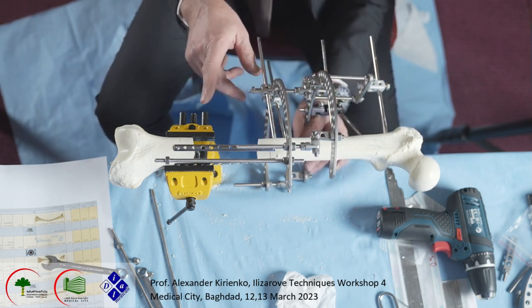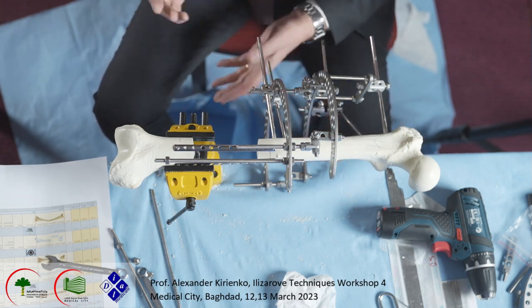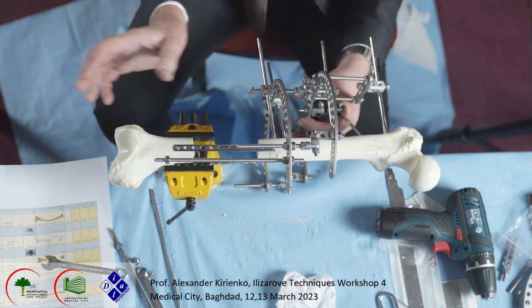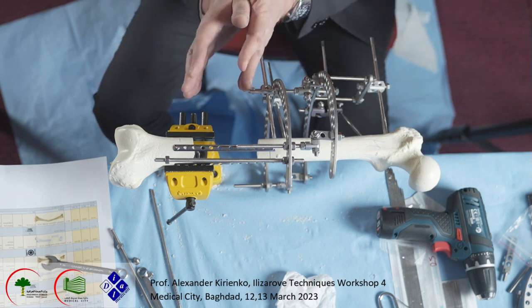For this reason, you may do shortening, but no more than 6-7 centimeters. It is dangerous to do 7 centimeters, I think. But in any case, you do shorten it because it's more comfortable for realignment, and the frame becomes more stable.